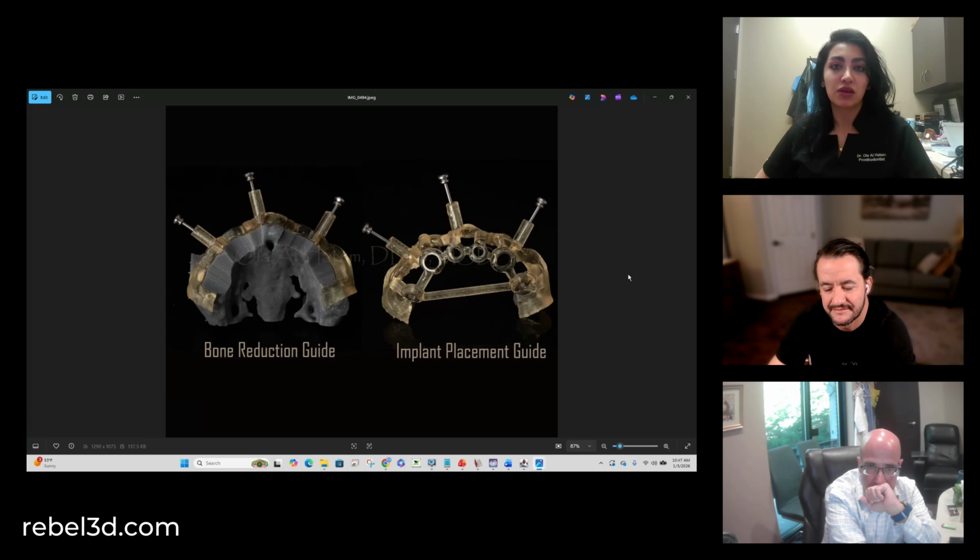If you're able to see and feel the bone, then you will get your primary stability, no matter how sparse the bone is in the patient, even in a terminal dentition case. You are actually feeling the bone. This is what Dr. Iskandar is harping on. It's very important, as surgeons and surgical prosthodontists, for our plan to match the execution and to keep it prosthetically driven while getting guaranteed results. With dynamic navigation, we can guarantee that to our patients.